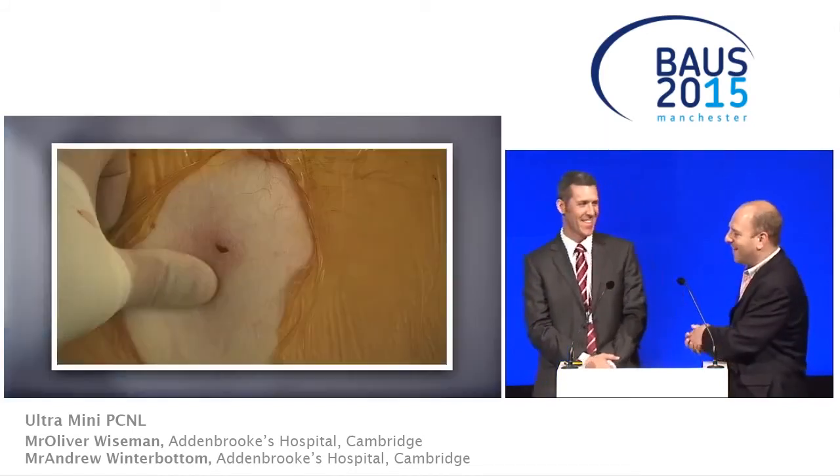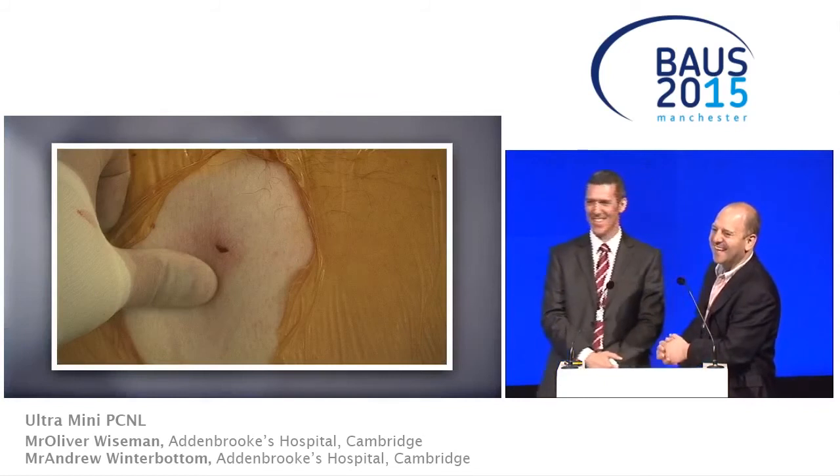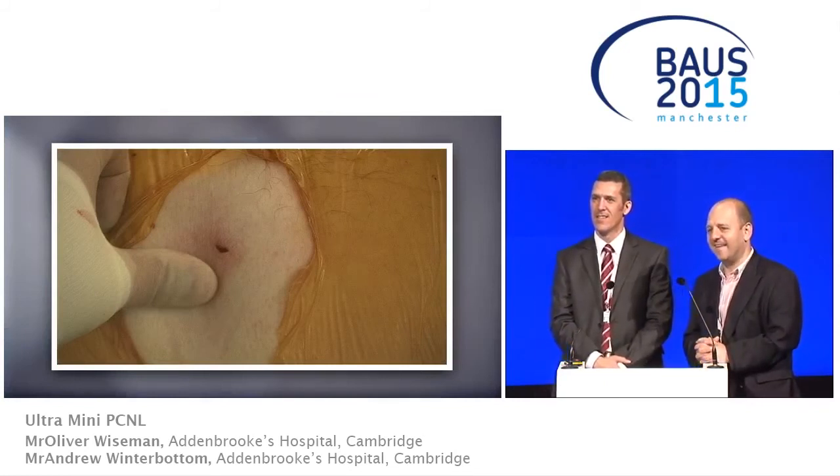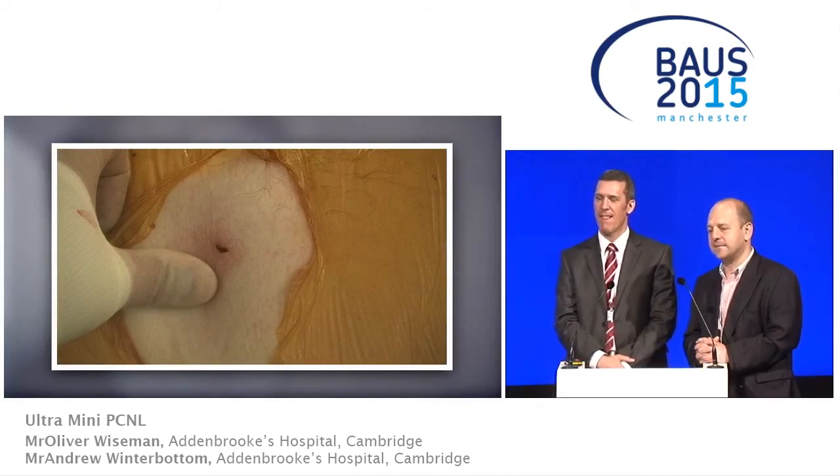Let's go to microphone 3 and then microphone 1. Hi, Sam Latta, Colchester. Ollie, when you put the wire in outside the sheath, did you find when you were trying to create the Venturi effect with the side port that it leaked and it wasn't as effective?